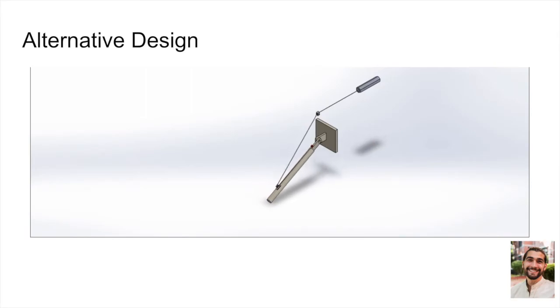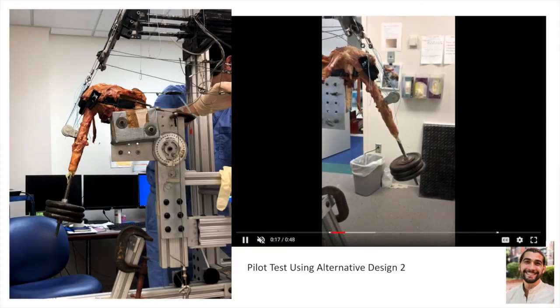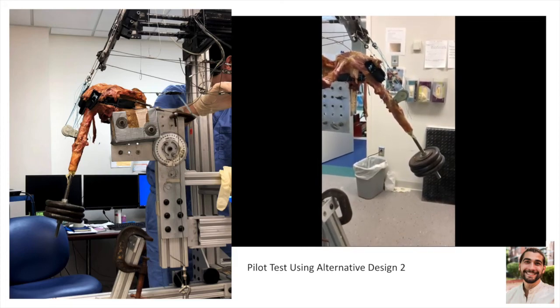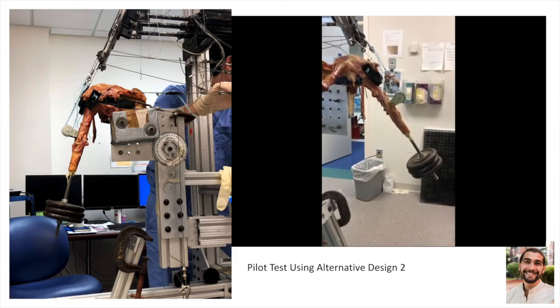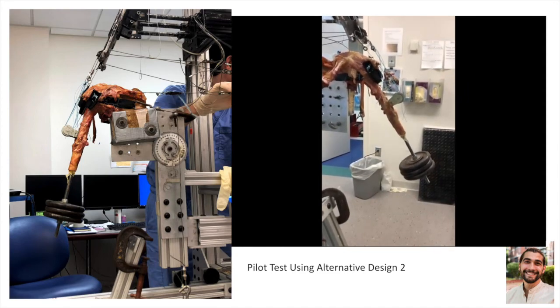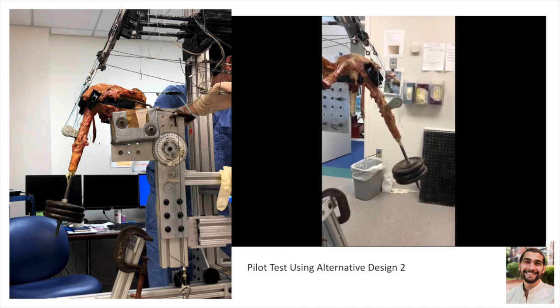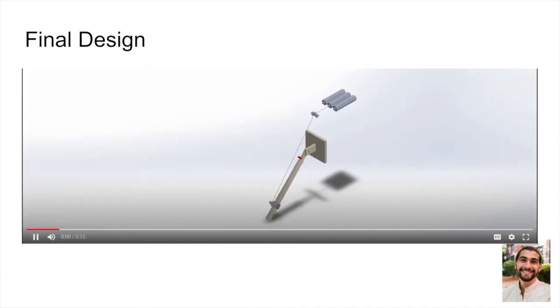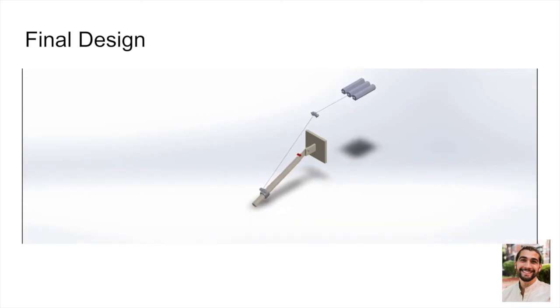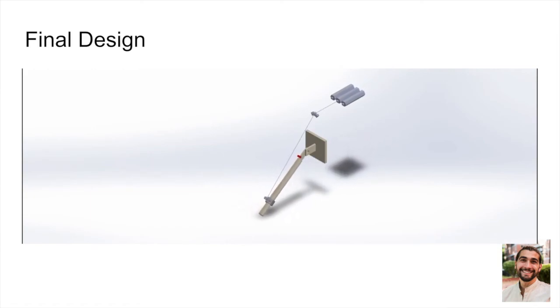So here is a design we actually had working at UConn Health. One pulley, 3 fibers. This didn't really work well either, mainly because we found there was catching between the different fibers as they moved through that single pulley, and we can definitely assume there's an increased amount of friction there. So moving to our final design, we just have 3 separate actuators with 3 separate pulleys on the bottom. This reduces that friction, reduces the catching, and it also gives us a better picture of all 3 fibers while freeing up space on the humerus for other attachments we needed to complete the project.